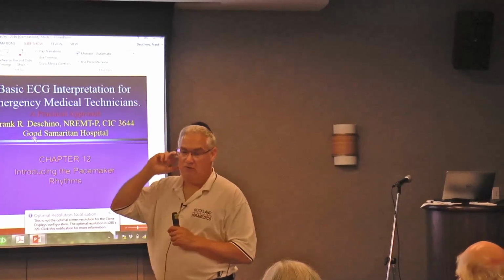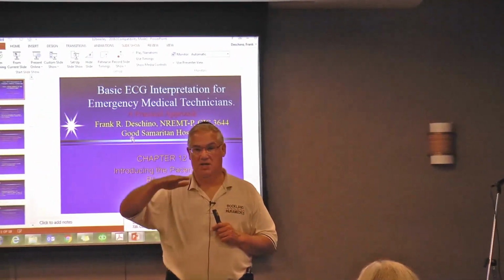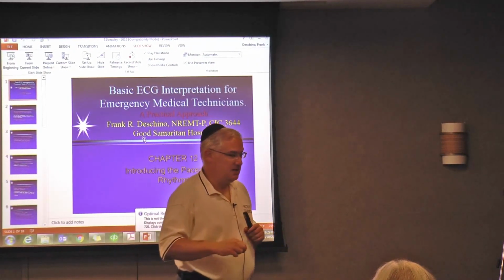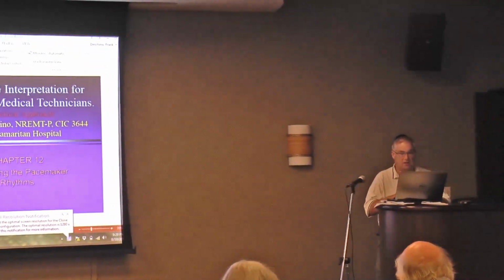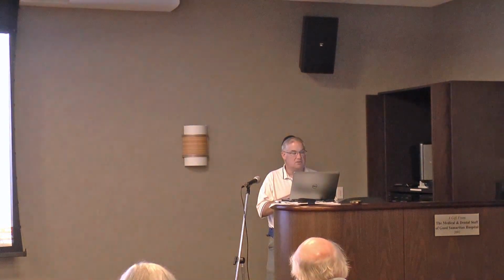Most people do not call a first degree AV block an abnormal rhythm anymore. They would say a patient has a sinus rhythm with a first degree AV block, signifying that it is typically not a symptomatic situation. The patient does not need to be treated, and there's nothing really to do for that patient. But when we go on to the higher level blocks, it becomes more worrisome for the patient, or for us.